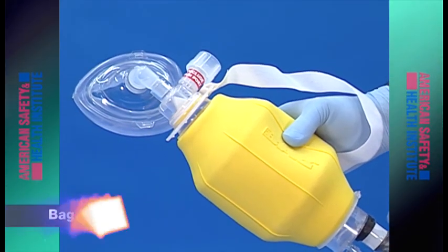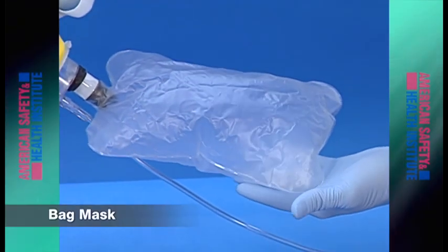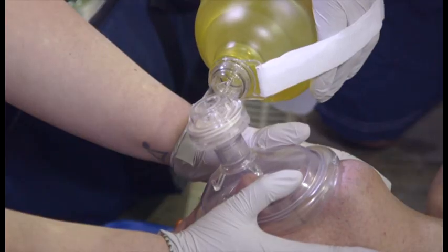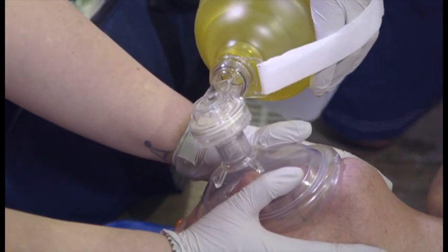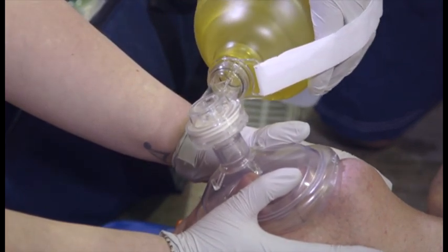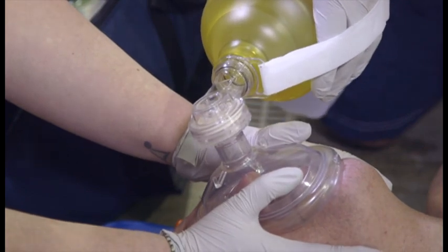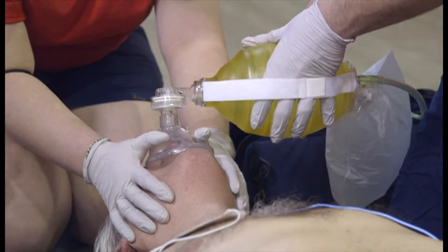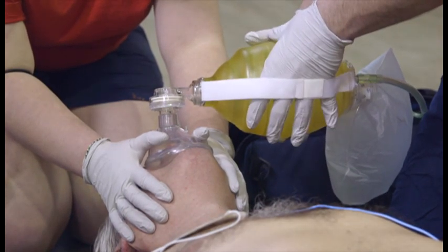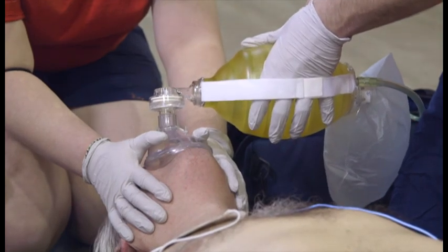A bag mask device, or BVM, uses pressure created by squeezing a self-refilling bag to force air containing oxygen into a patient. With an attached reservoir bag connected to a 10 to 15 liter per minute flow of oxygen, this device can provide nearly 100% oxygen concentrations. A BVM is primarily an option for healthcare professionals and professional rescuers.